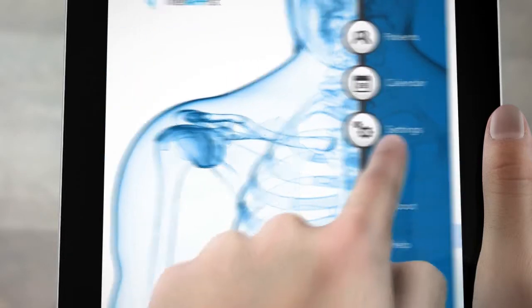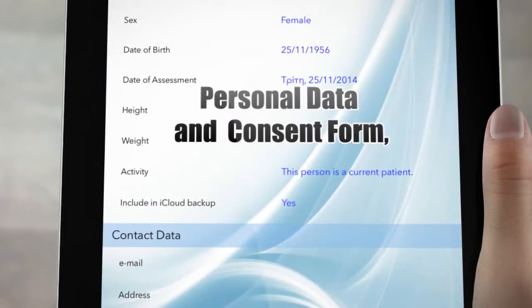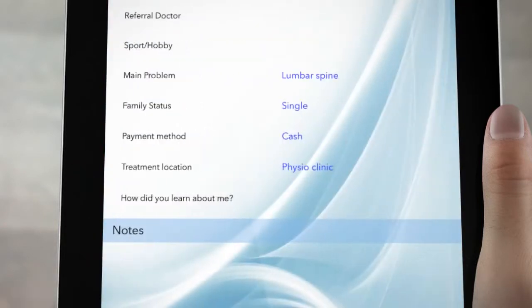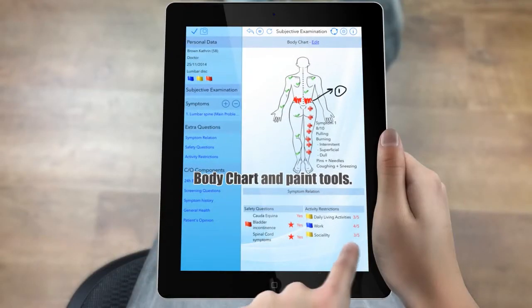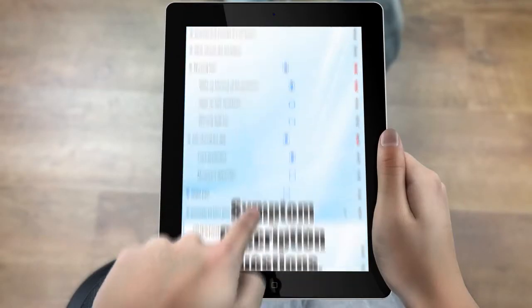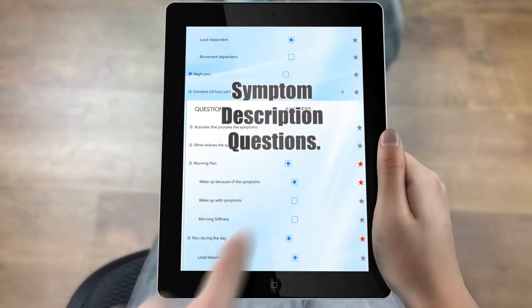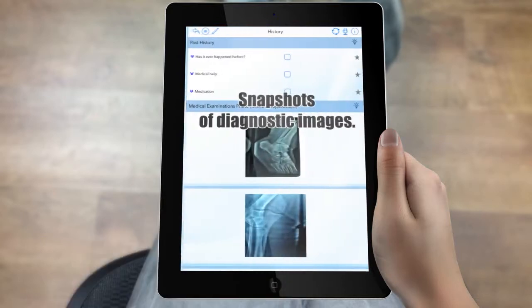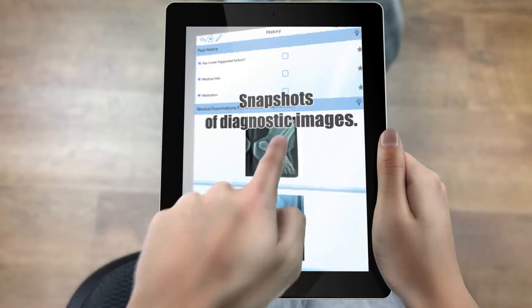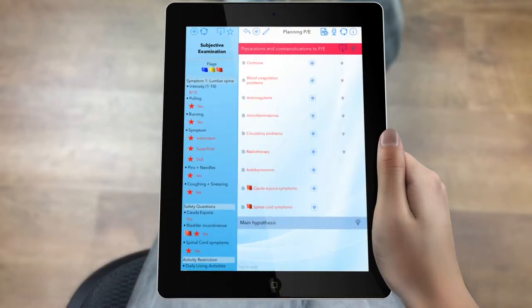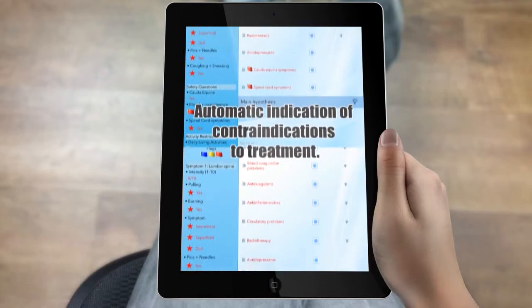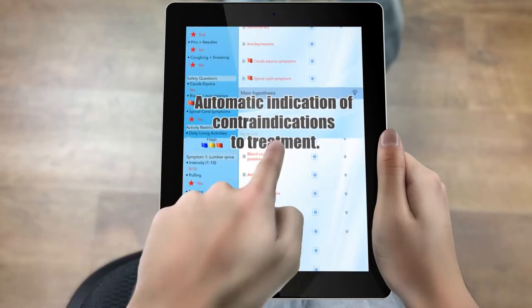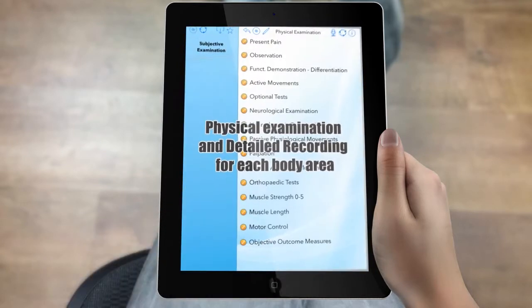You can now have all of your patients saved on your tablet. That includes personal data and consent form, body chart and paint tools, symptom description questions, taking snapshots of diagnostic images, automatic indication of contraindications to treatment, and detailed recording for each body area.